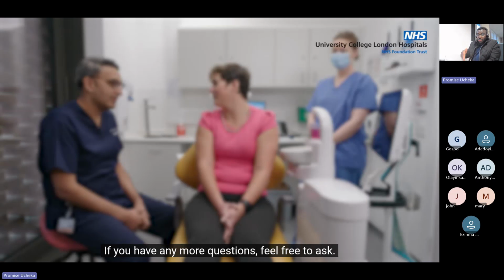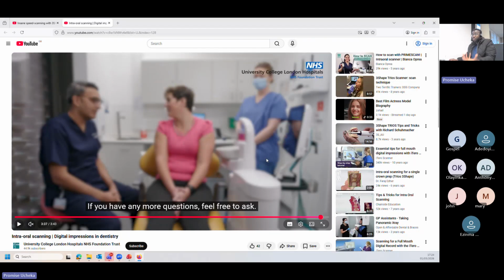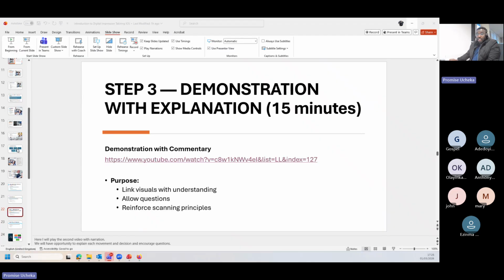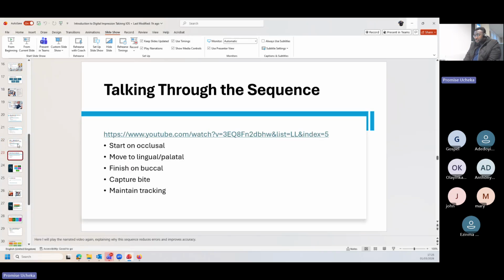Okay, and you can see that they also had that communication with the patient even while they were performing the scan, letting the patient know when they are doing the lower jaw and the upper jaw, and also using that scan to actually explain the treatment plan. If you looked very closely, you may have found that even where the patient had calculus and some deposits in the mouth, those were also very clearly visible in the scan. So for treatment planning, intraoral scanners can be very effective.